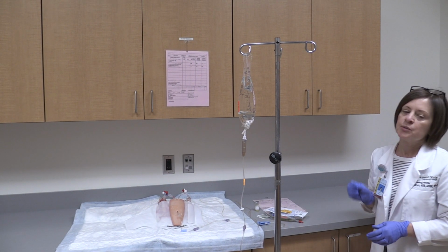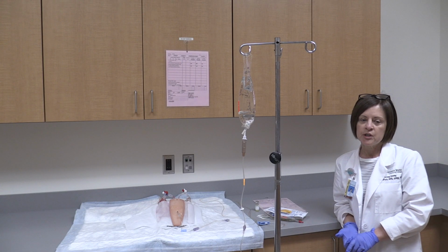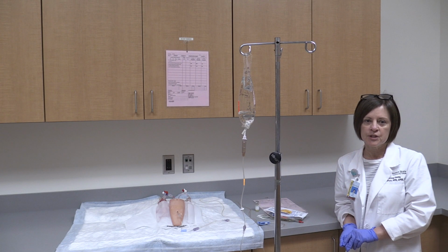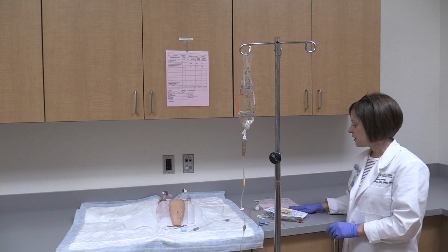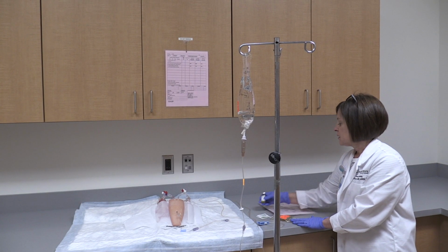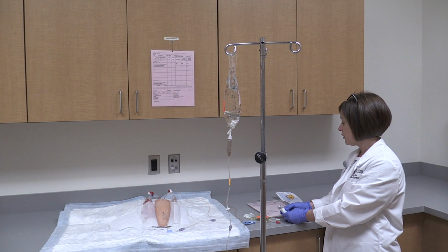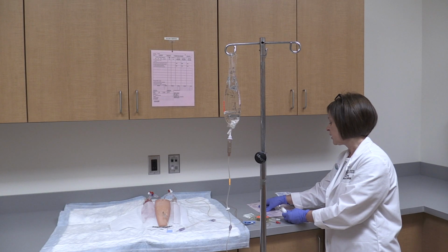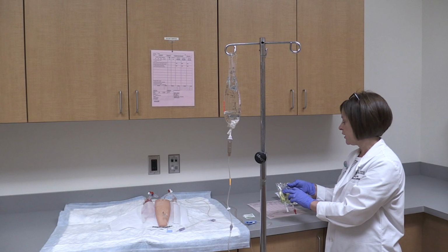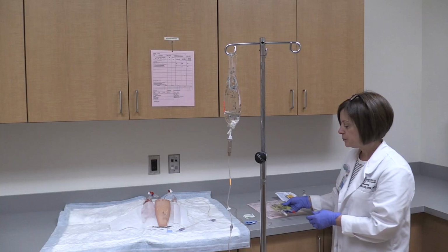Now that I'm in my patient's room, I'm going to verify their name and birth date using 2 identifiers. I'll ask the patient their name and birth date, and I'll verify that with their name band. I'm also going to verify their allergies with them. And I'm going to do my 3rd check on my medication. I am verifying that I do have the cefazolin 250 milligrams per ml, which is what it says on my MAR, and that I've added that to my 0.9 sodium chloride 50 mLs, and it will run at 100 mLs an hour.